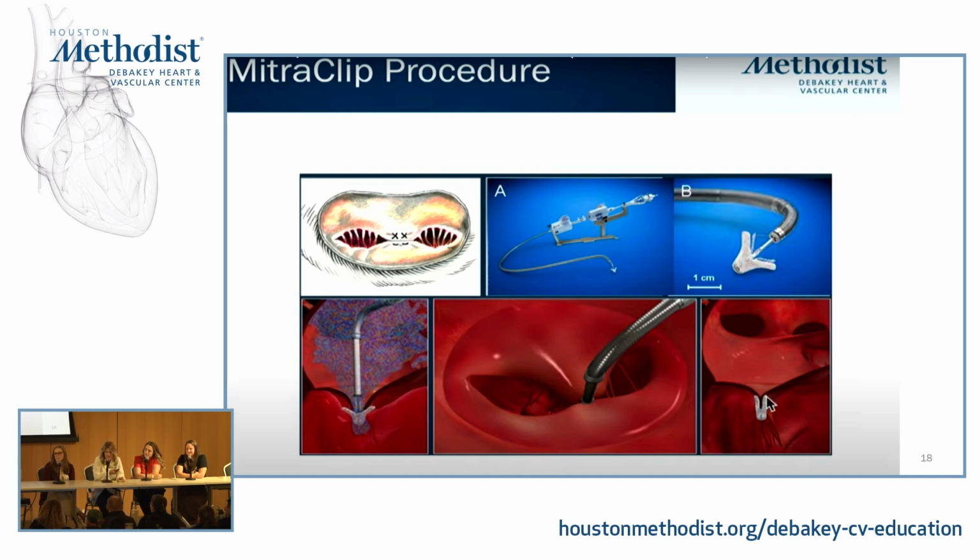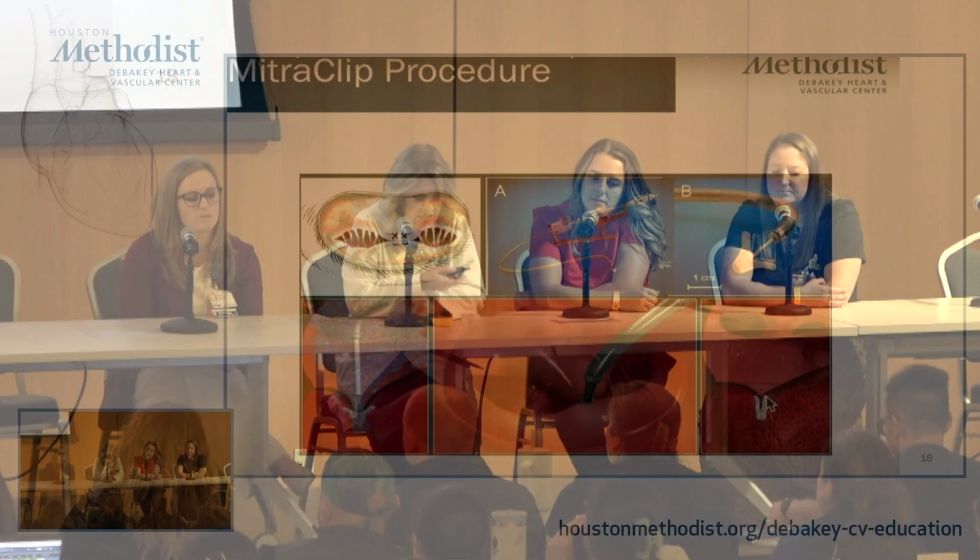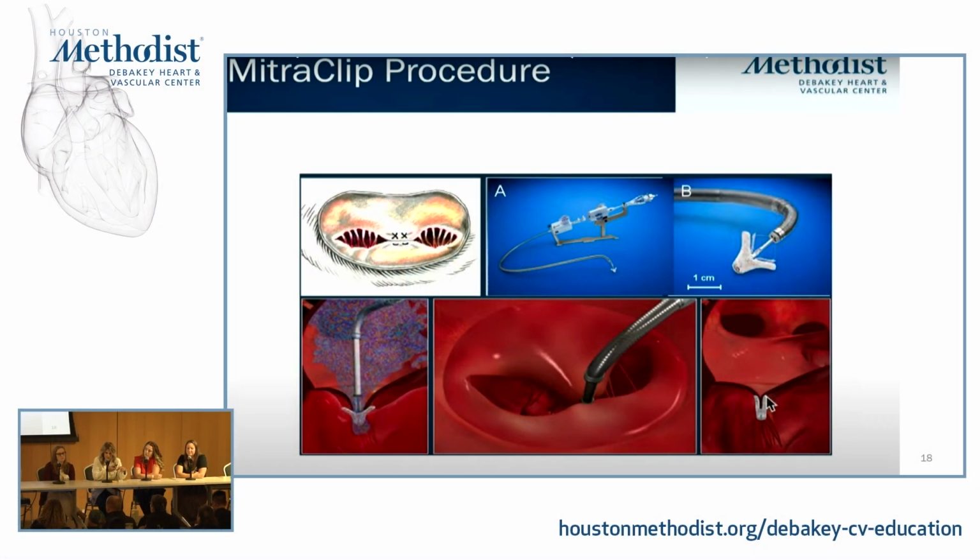So they advance the catheter, and then they puncture through the atrial septum into the left atrium. And then they go down through the orifice. And the X's on the screen in that first box, that's actually where the clips would go. So what they do is they advance this down below the orifice, and then they pull it up, grabbing the two leaflet ends, and the interventional cardiologist will determine where he wants to place those in the orifice. Now, he can use one clip, he can use two or three, depending on what he needs to do to get the best outcome. And then at the end of the procedure, you'll see that two orifices are created. So this hopefully will improve and decrease the reflux that we see through the mitral valve.